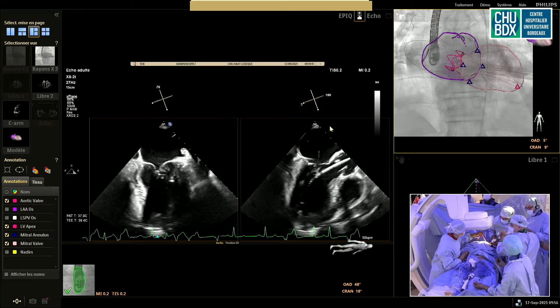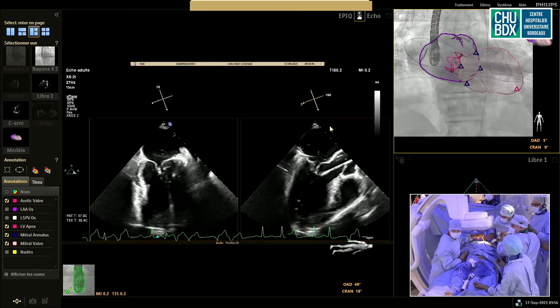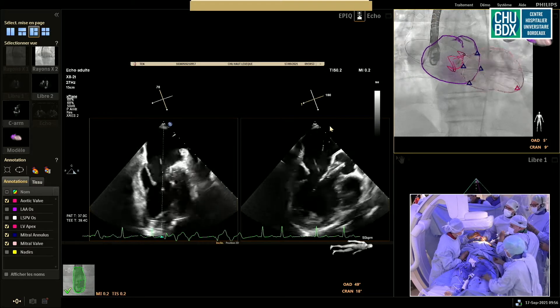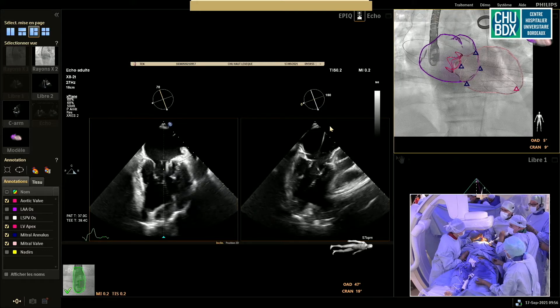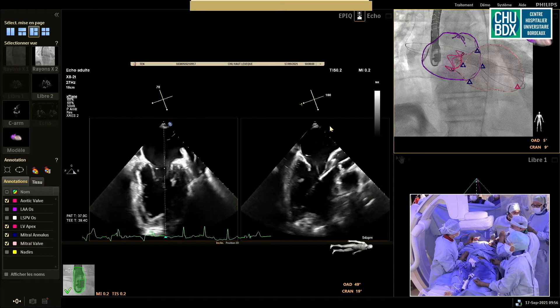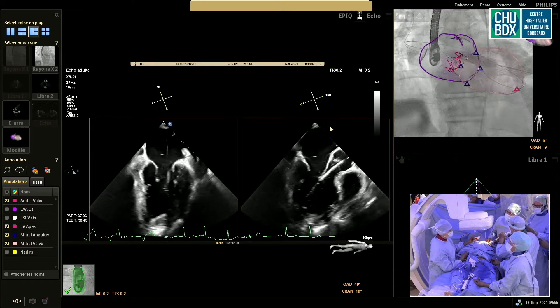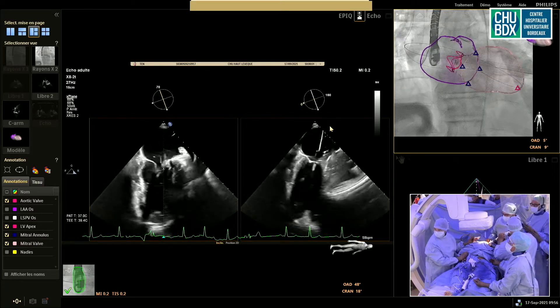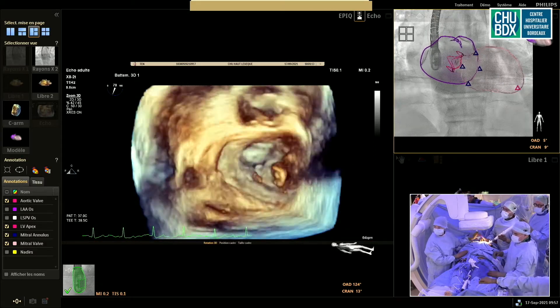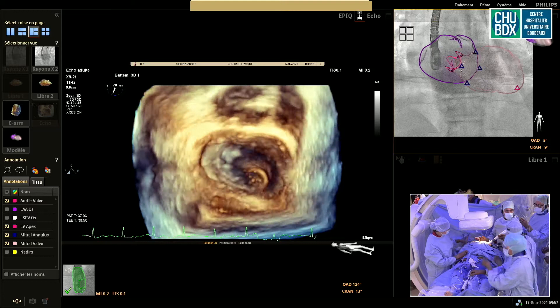We passed the apex now, so it has to be gentle movements — clockwise, anticlockwise. And you see on the echo the pressure on the apex? The system is coming. We are in the atrium already.